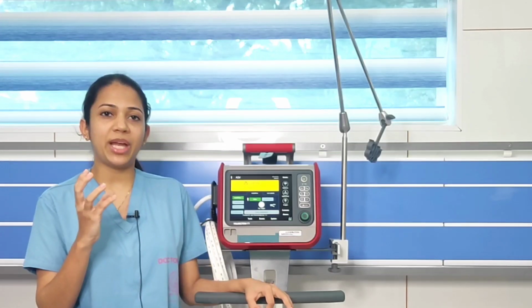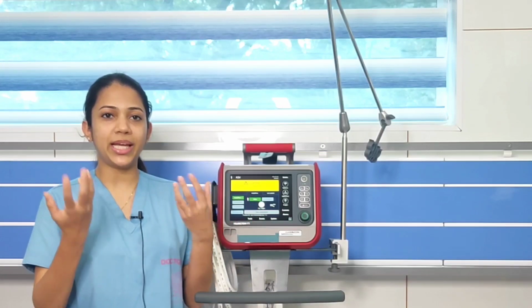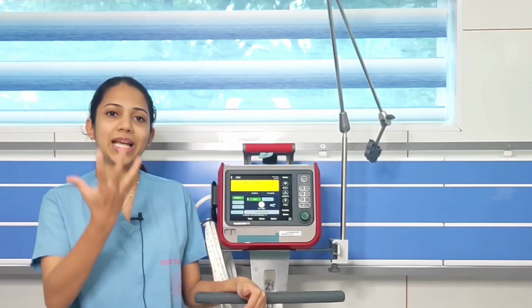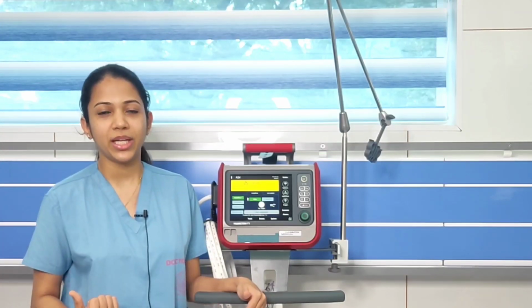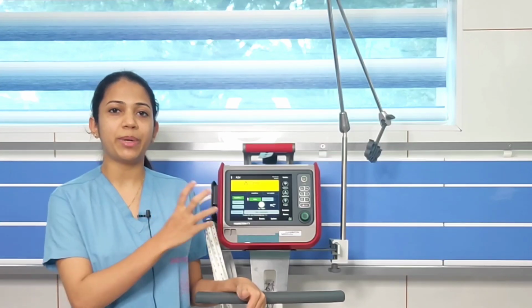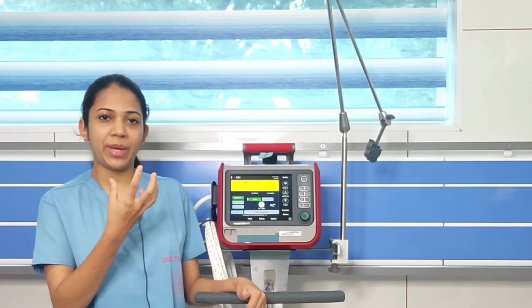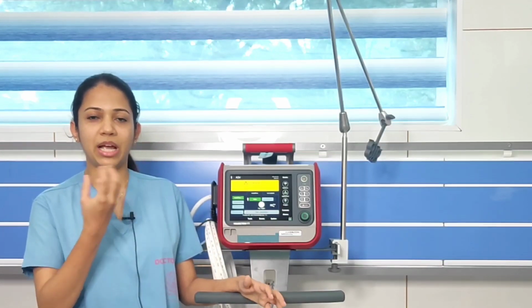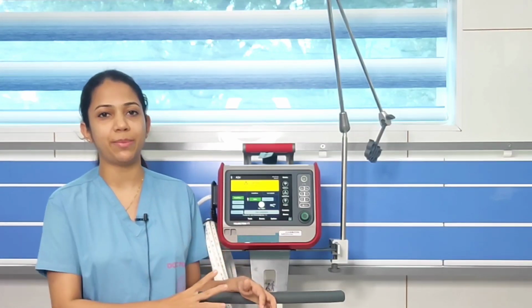Suppose the patient is making a respiratory effort. In order to take an inspiration or a breath, the patient will have to create a negative pressure. Suppose we are setting the pressure trigger as -1 centimeter of water. If the patient makes an effort of -1 centimeter of water, that negative pressure will be sensed by the ventilator, and the ventilator will support that.